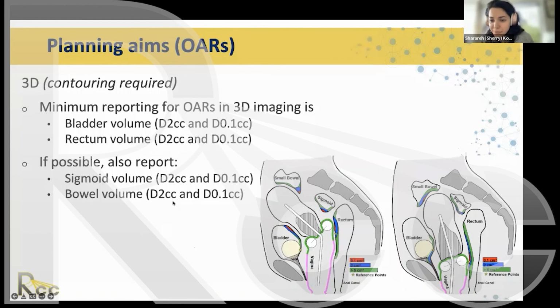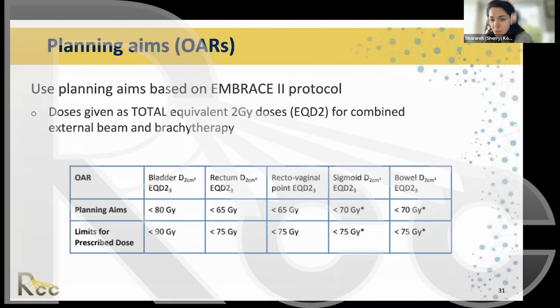Wonderful. And there's also another question. If you have the same source arrangements for different patients' anatomy using your HDR unit, for instance, small tandem, medium, and long. Yeah. So we would want to have a standard loading pattern for each combination of tandem and ovoids that we were going to use. So we wouldn't want to use the same loading pattern for a smaller tandem that we would use for a larger tandem. So we would need to have sort of a bank or a library of standard plans. Great, thank you so much.